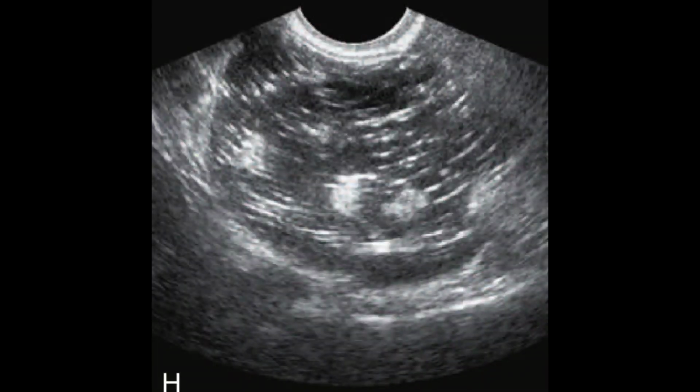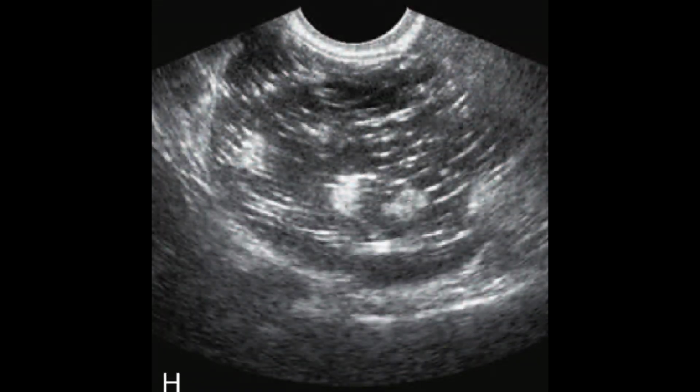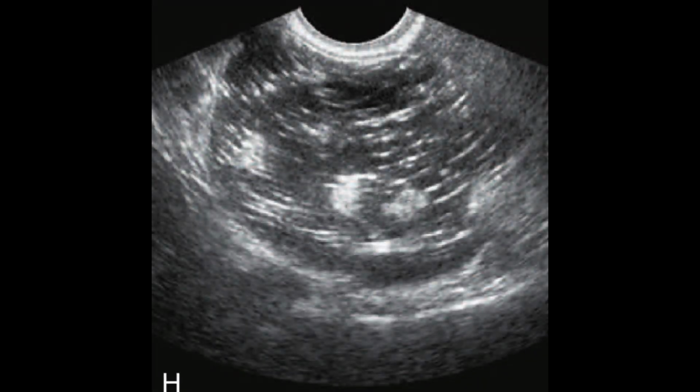This is another transvaginal scan, and on it a complex cystic lesion can be seen. If you're not focused, you might miss it because it looks like a very weird pattern, and this is also called dermoid mesh. Within this dermoid mesh, the one thing you can appreciate is that highly reflective lines are visible. These tiny interrupted lines are called dermoid mesh. This dermoid mesh has small tiny dots and echogenic lines. This is the one finding, and the second is you can also appreciate small tiny or larger dots as well. So these are dots and tiny lines forming a dermoid mesh.